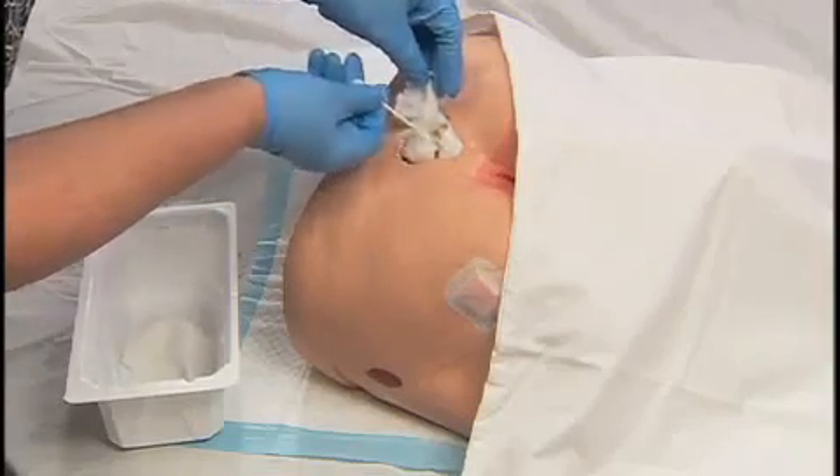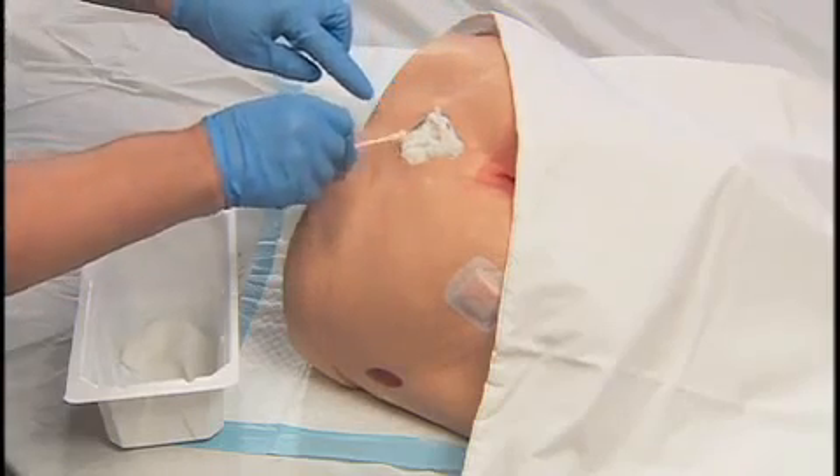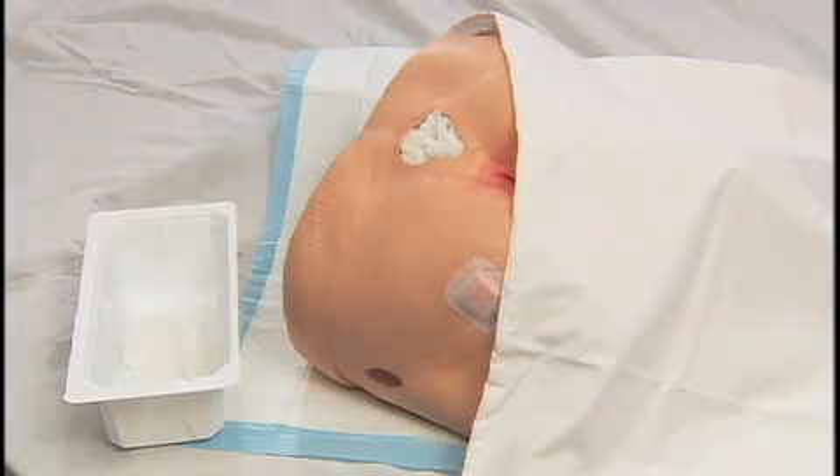Fill the depth of the wound to the surface. Packing should touch all open wound surfaces and fill all open cavities within the wound.